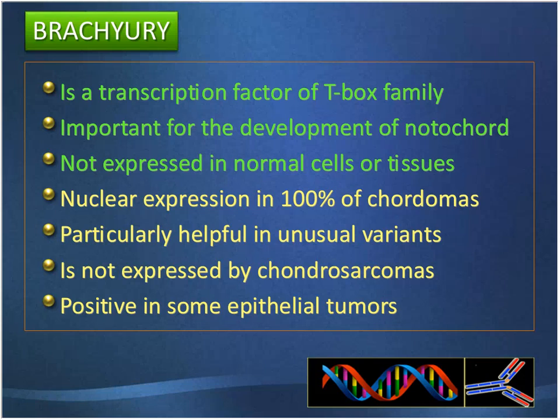Therefore, in that differential diagnosis it is less helpful, but it could be helpful when you have an unusual form of chordoma that one does not think about, or there is no clinical evidence to think about it.